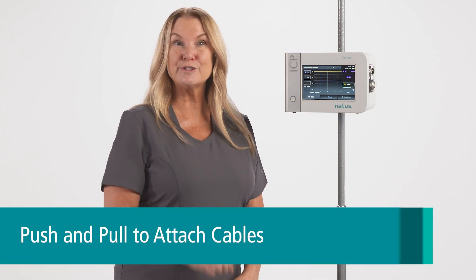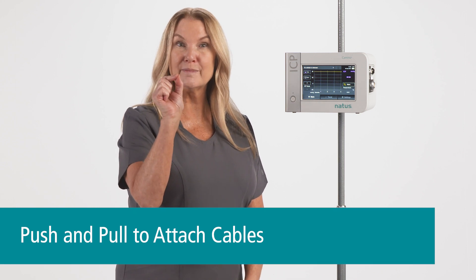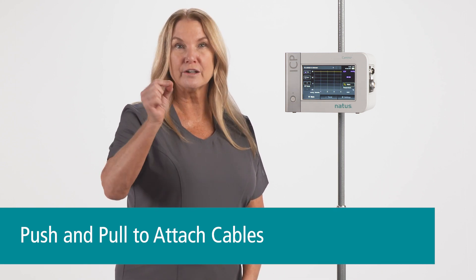Let's review the cables that come with the Camino ICP monitor. All the cables are color-coded to easily recognize where they attach to the Camino monitor. Also, all cables attach and detach using a push-pull method — no turning or twisting.